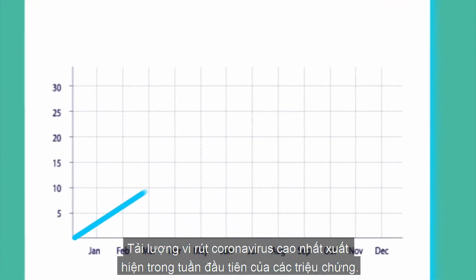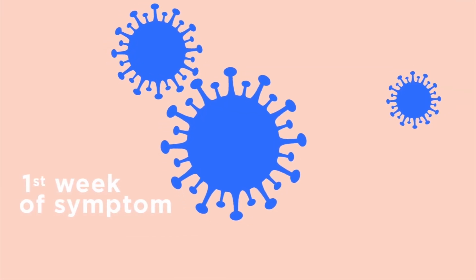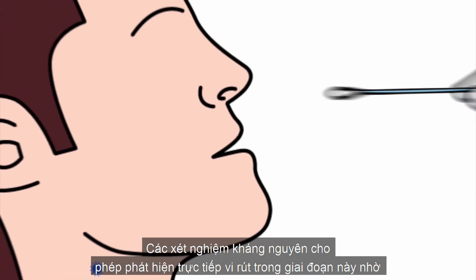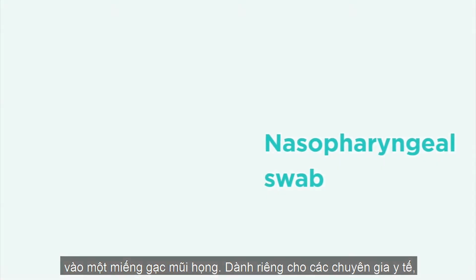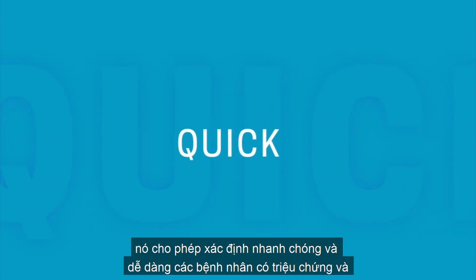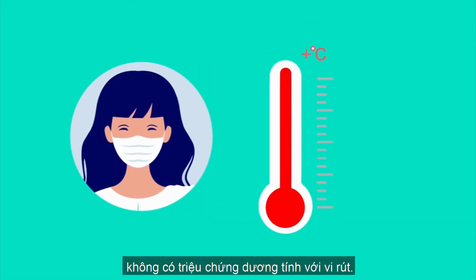The peak of the viral load of the coronavirus appears during the first week of symptoms. Antigenic tests allow direct detection of the virus during this phase thanks to a nasopharyngeal swab. Reserved for health professionals, it allows quick and easy identification of symptomatic and asymptomatic patients who are positive for the virus.